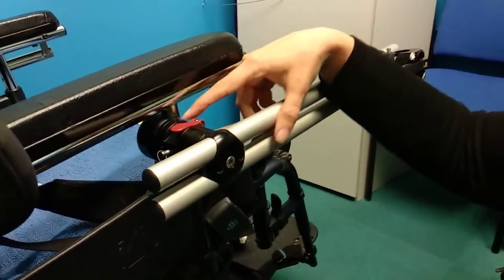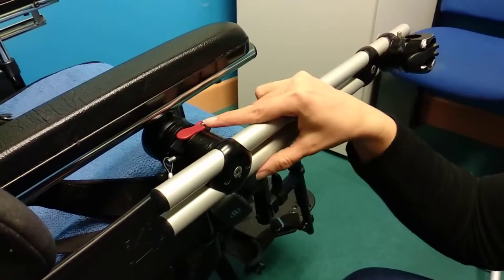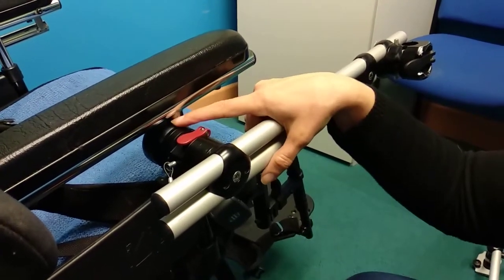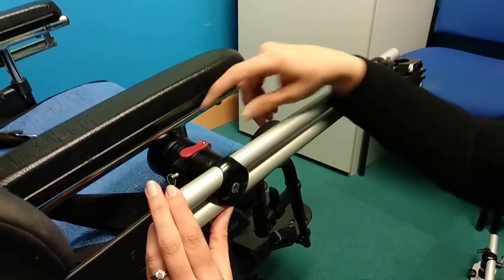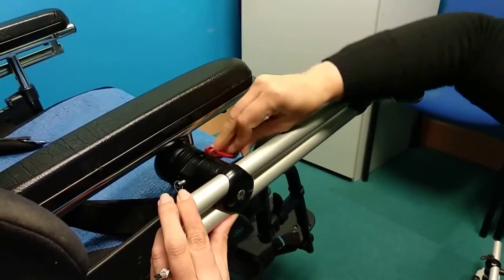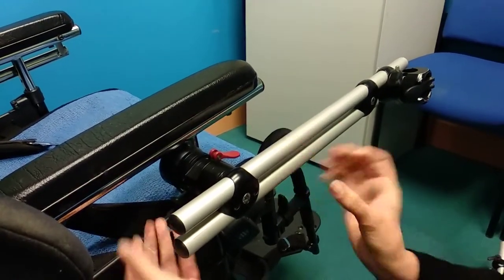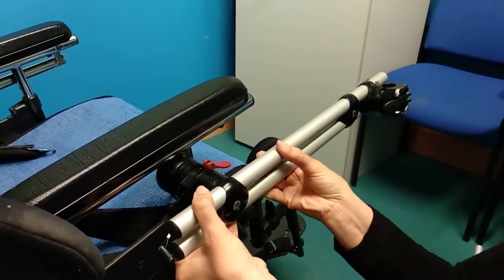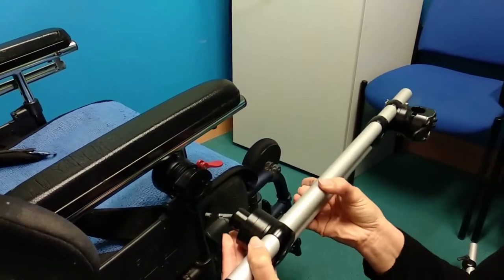This is the part of the mount which has the red latch and the pin on it, attached to the chair via the frame clamp. To remove the Monty 3D mount, we need to undo the latch and also undo the pin, and then do a slight jiggle and pull it out from the mount.